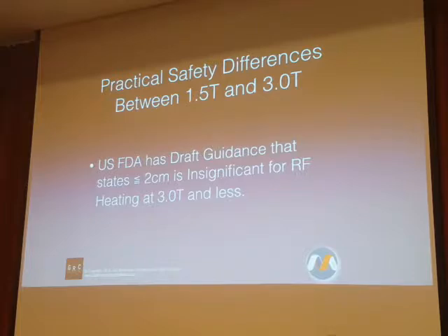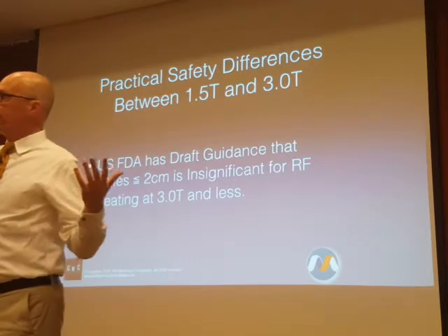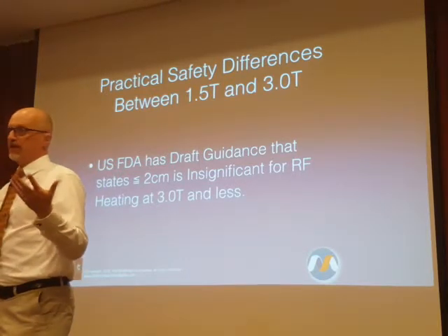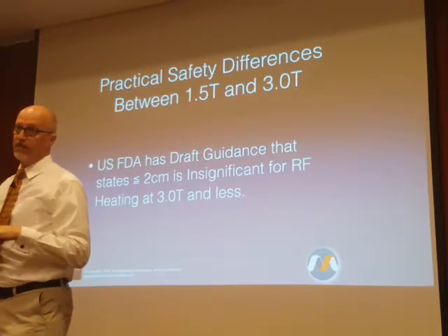I was in contact with a friend who works at the US FDA who's doing research. He was actually pushing for, not related to this draft guidance, but with his own research, a 5 centimeter threshold as well. So that's kind of where I fall right now, is if it's 5 centimeters or less, I don't think it's a significant risk for RF heating, for something internal to the body of the patient.